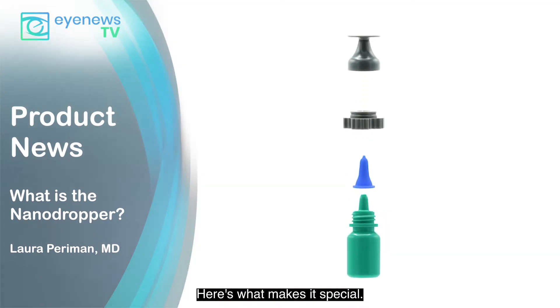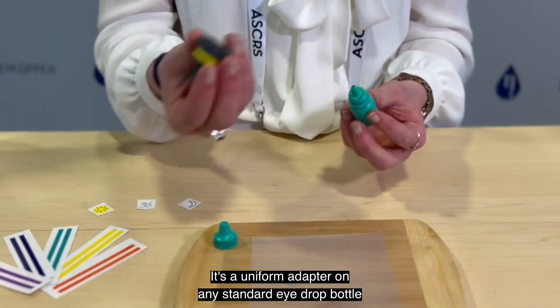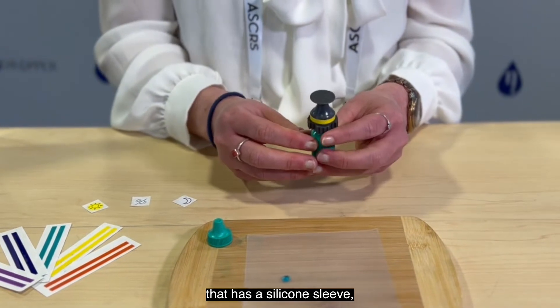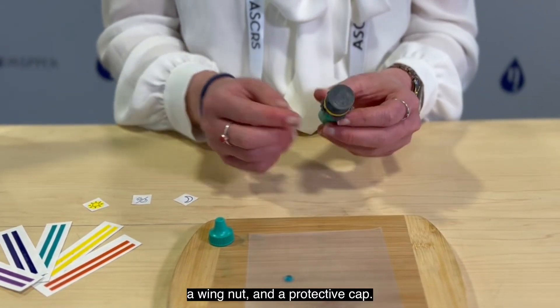Here's what makes it special. It's a universal adapter on any standard eye drop bottle that has a silicone sleeve, a wing nut, and a protective cap.